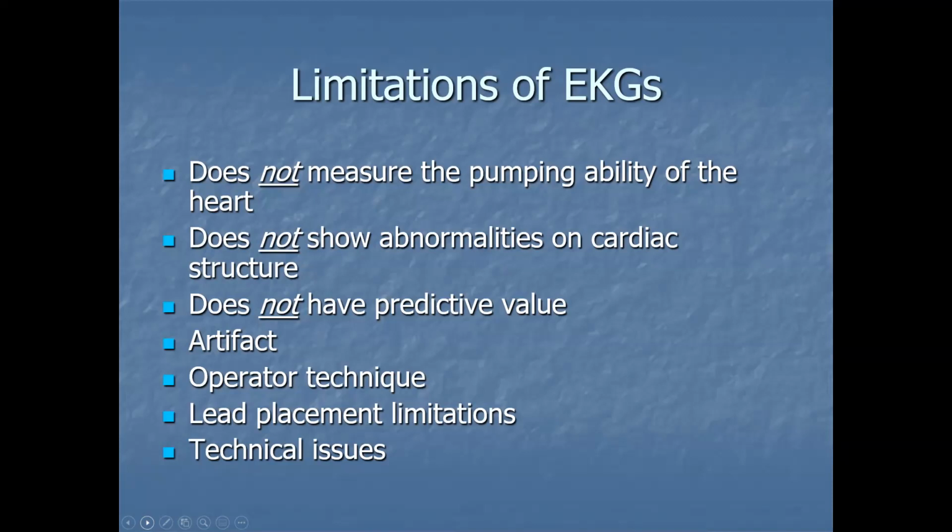You can have artifact that can occur. So you can have a monitor that was placed on demo mode, and the demo was to show supraventricular tachycardia, but it's never been converted back to a monitoring mode. So you could have the screen demonstrating supraventricular tachycardia when the patient may in fact have a normal sinus rhythm. Operator technique, so just improper lead placement, or if it's not even improper, a few leads fell off, a cable became dislodged, something along those lines. Lead placement is another form of a limitation, and then generally speaking, any other technical issues.